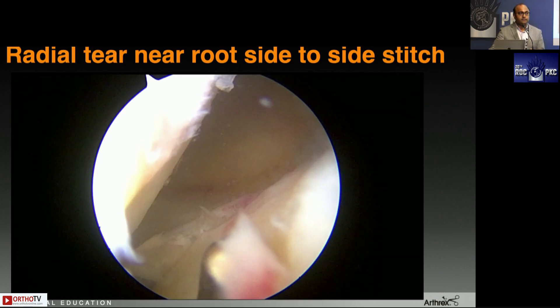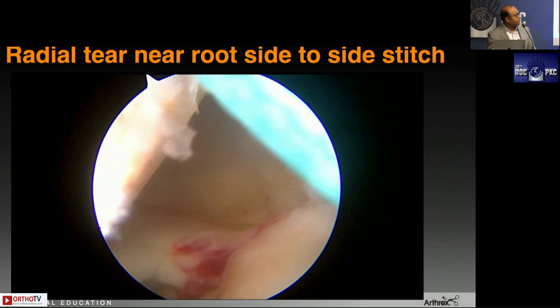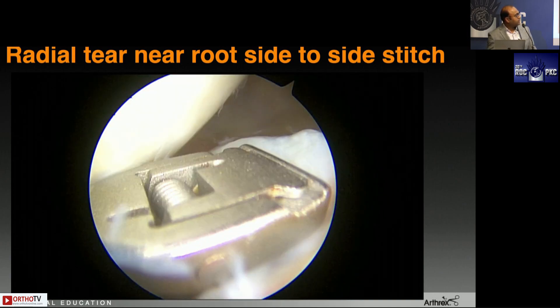One of the most common indications of the knee scorpion is side-to-side stitches. The side-to-side stitches are especially relevant, and the most common indication for a side-to-side repair is a radial tear near the lateral meniscus root. As you saw in the morning session, another device was used for the same purpose — I will try to show why the knee scorpion makes life very easy. That's the lateral meniscus root — it's the right knee, visualization from the medial portal, instrumentation from the anterolateral portal.